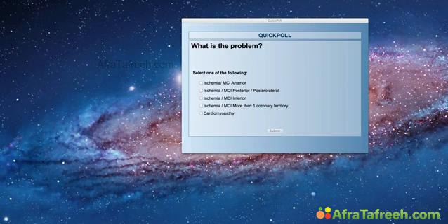Ischemia. So basically the question is, does the patient have coronary artery disease, or does the patient have dilated cardiomyopathy? And if the patient has coronary artery disease, which vessels do you think really have a problem? Okay. I can see most of you have now voted. I will close the vote in a few seconds. So if you still want to vote, now is the last chance you have.